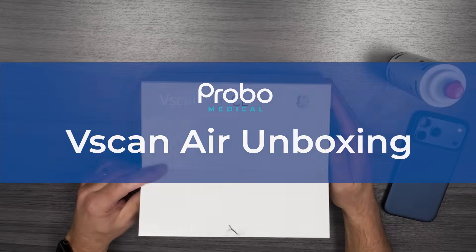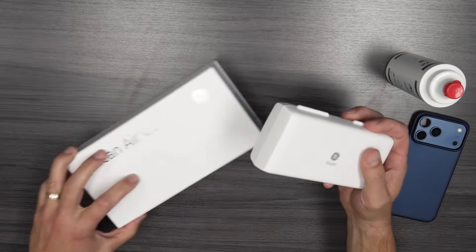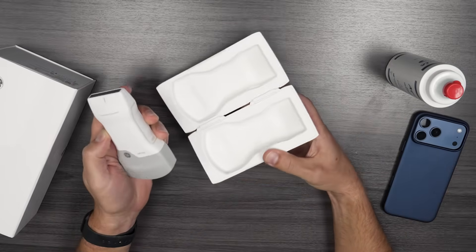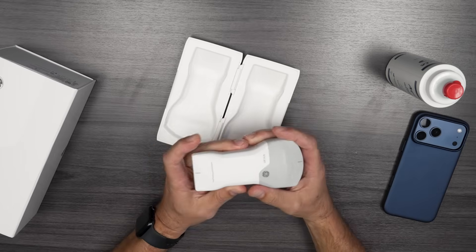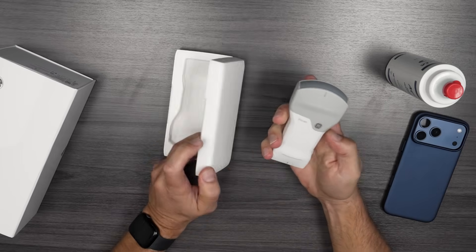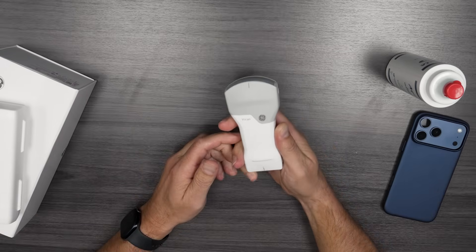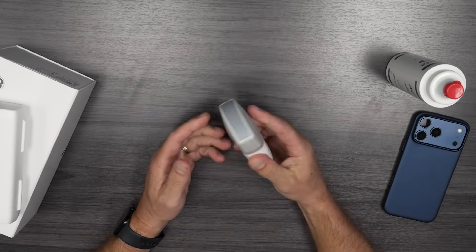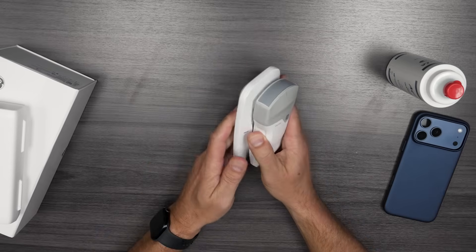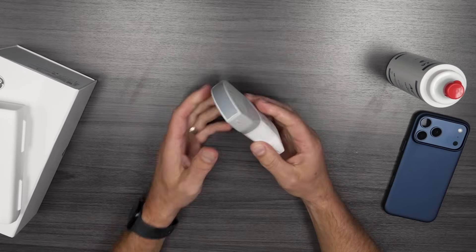This is the vScan Air CL. It comes in a nice little package and a handy little case. You open it up and there you have your convex and linear probes. The first thing you notice is there's no cables — a lot of portable handhelds have a cable you connect to your phone, which drains the battery and prevents charging. This comes with a nice little wireless charger and USB — just lay it down and it charges automatically.